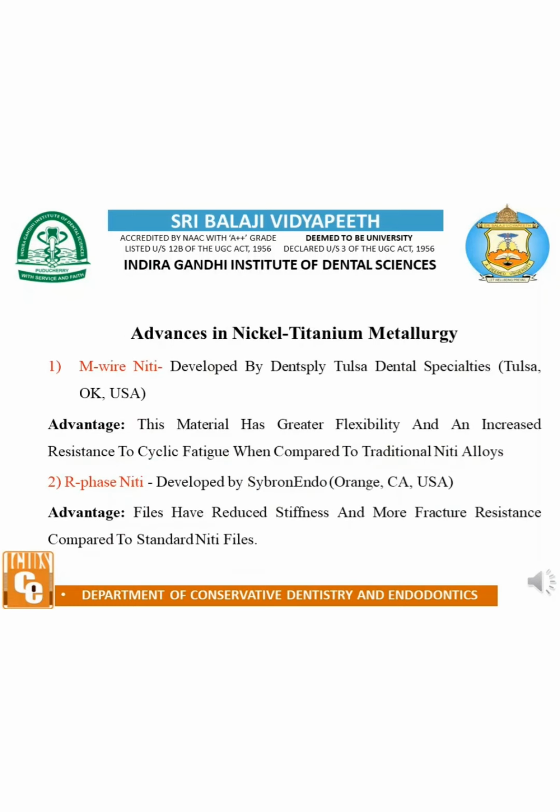Advances in nickel titanium metallurgy. M-Wire nickel titanium, developed by Dentsply Tulsa Dental Specialties. Advantage: this material has greater flexibility and an increased resistance to cyclic fatigue when compared to traditional nickel titanium alloys. R-phase nickel titanium, developed by SybronEndo. Advantage: files have reduced stiffness and more fracture resistance compared to standard nickel titanium files.